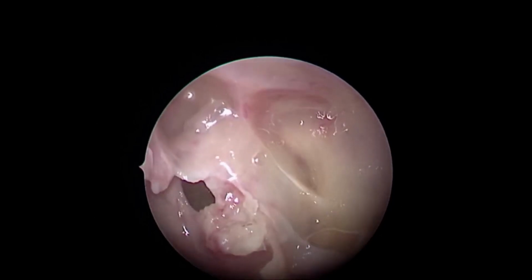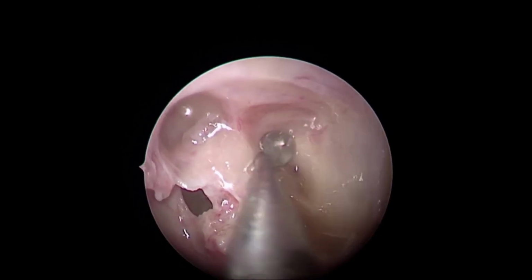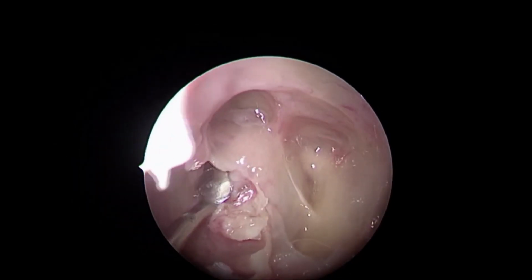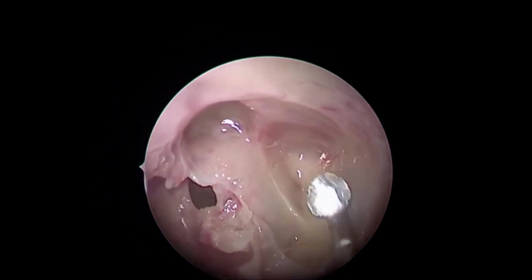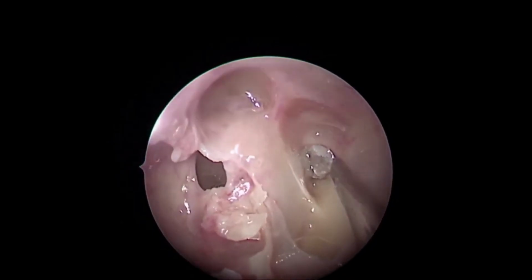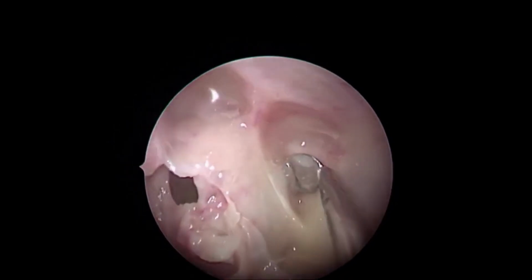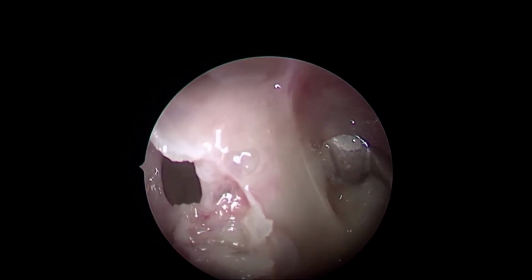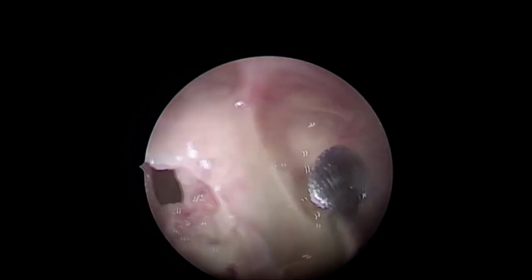This is the optic nerve. See the post-ethmoidal cell taking directly to the optic nerve. Without knowing the sphenoid ostium as my posterior limit, if I go behind and look for my sphenoid sinus behind, it would be a disaster. I will end up making the patient blind. That would be a disaster.